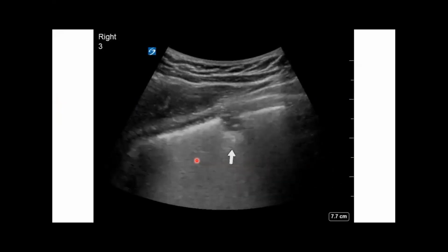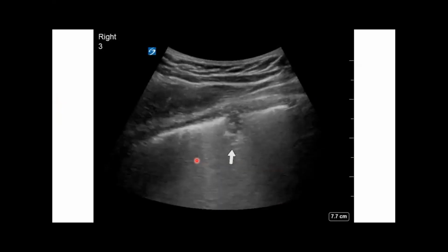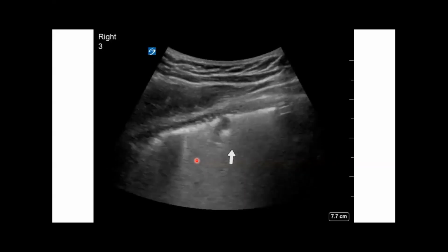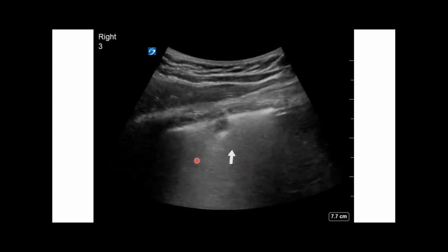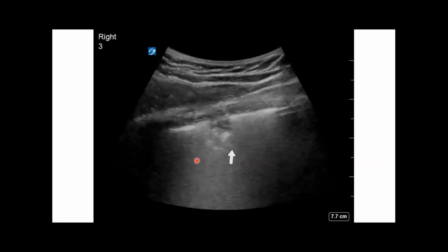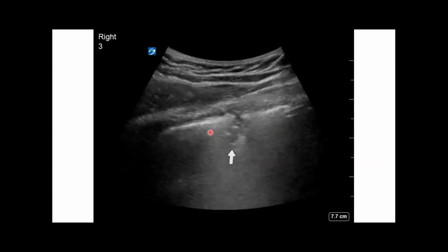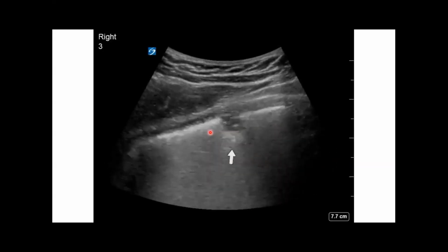So if you think about it, why are you seeing these areas of skipped lesions of the lung? The coronavirus, typically they're suggesting that it's infecting the terminal bronchioles and alveoli. So you're getting all these peripheral lesions. And literally when you're seeing B lines in these peripheral lesions, you're seeing consolidated lung with aerated lung and then more consolidated lung. So your B lines are kind of stuck to that consolidated lung. And that kind of makes sense.